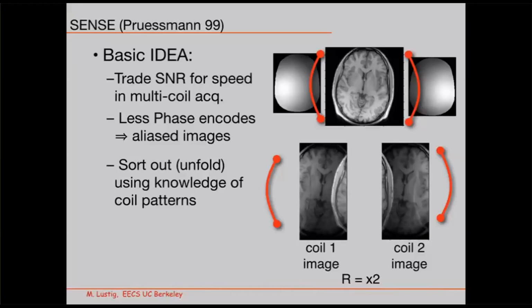So we talked about the basic idea of parallel imaging and its premise. For every phase encode, or every measurement that we make in an MR, because we digitize all the signal coming from each one of those channels, we have a lot of measurements coming out. It's not a single Fourier measurement.